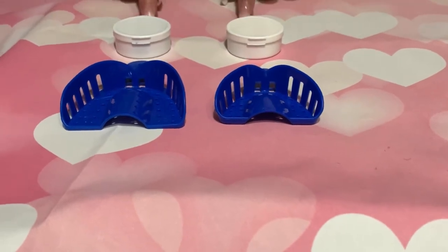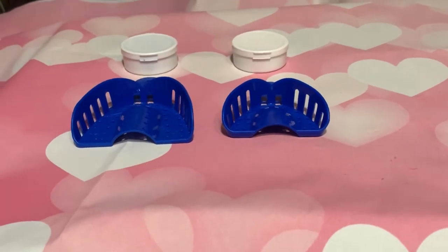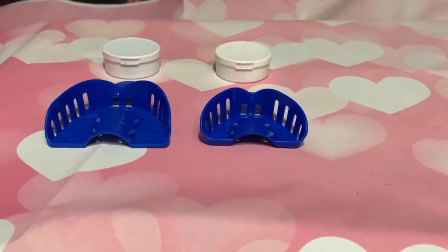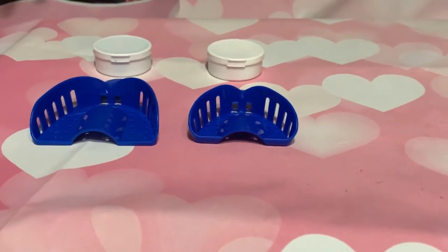And they'll send you 2 of these putties, and you're going to mix them. It's a blue and a white one. Because you've only got 1 shot of this, I really didn't want to mess it up, especially as expensive as they are. I mean, it's not $400 or $500, but hey, it's nothing to sneeze at either.